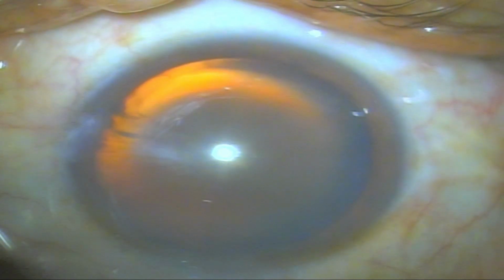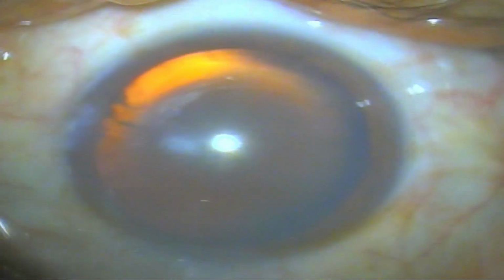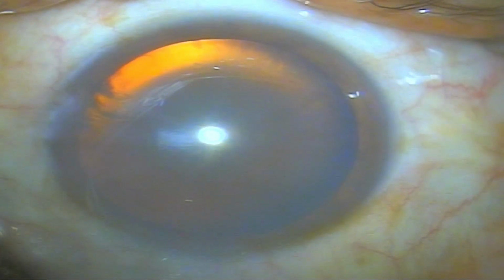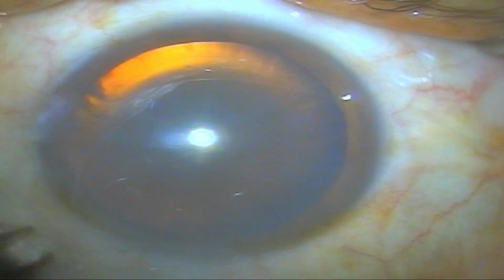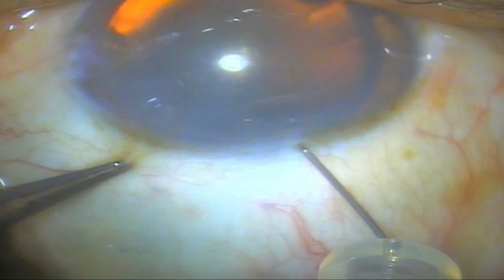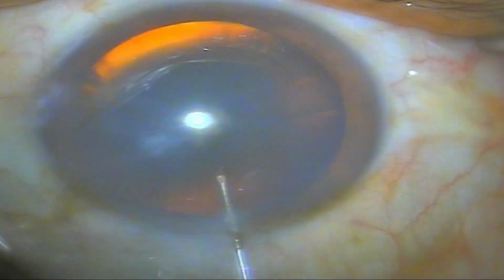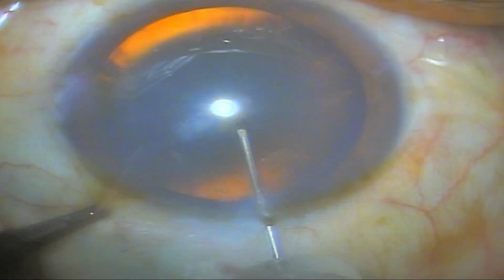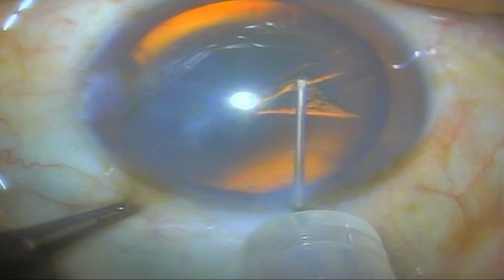We just put viscoelastic solution on the anterior surface of the cornea to provide hydration and clarity of the media. And now we will use the needle cystotome through the gray line, and we will again try to create a round rhexis in the anti-clockwise direction.